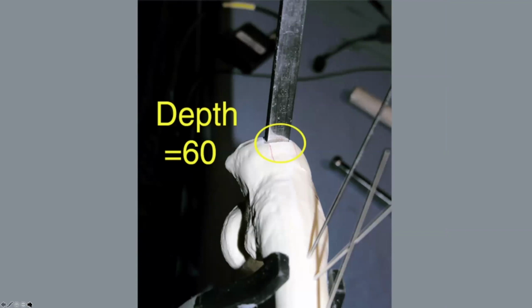These numbers typically on most of the blade plate seating chisels are illegible, but you should know how deep you're going to place this seating chisel before you start. It should be part of your preoperative plan. And you can look and do this. Now, back in the day, people weren't using fluoro to do this, and they would just tap in and base their entire osteotomy on these numbers. But we have the ability to confirm this with fluoro. And you should, at the same time, make certain that that seating chisel is going into the right part of the femoral head.